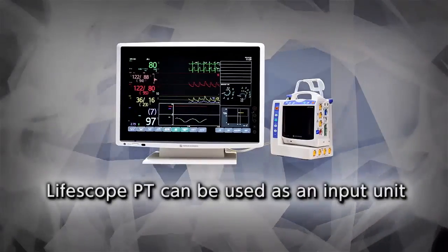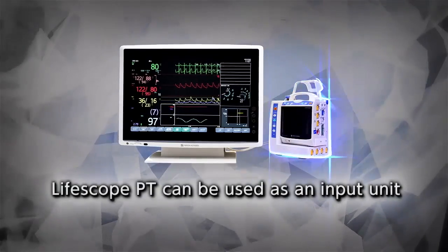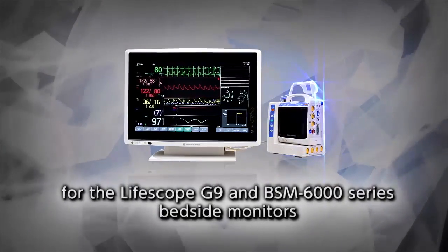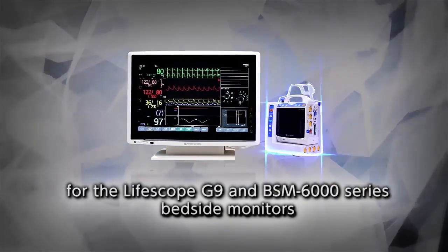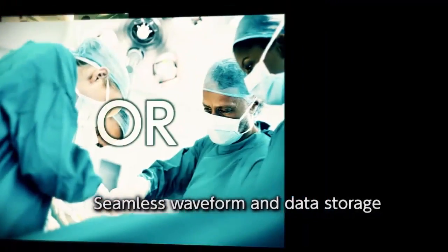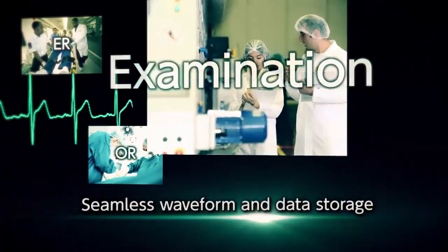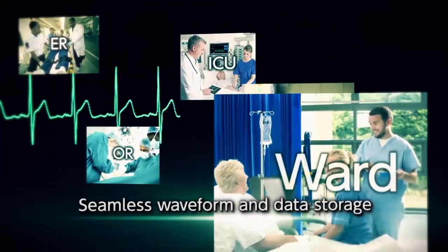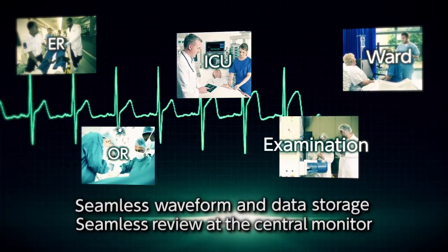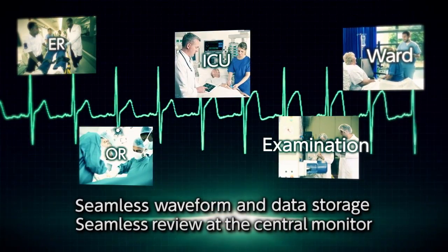The LifeScope PT Compact Transport Monitor can be used as an input unit for the LifeScope G9 bedside monitor. A seamless, uninterrupted record of all waveforms and data from both transport and monitoring is available at the central monitor.